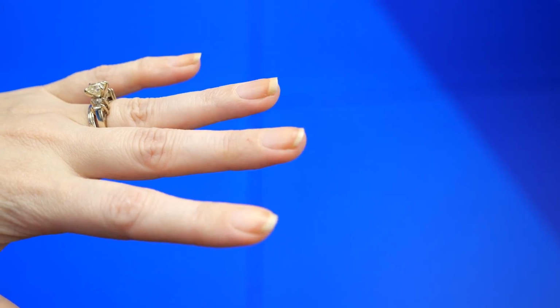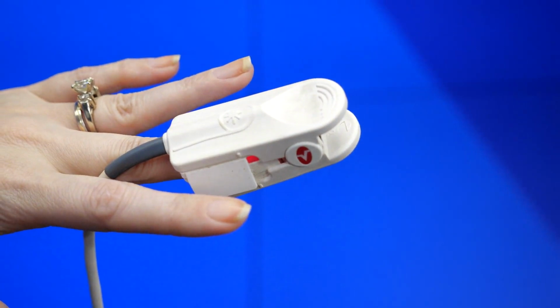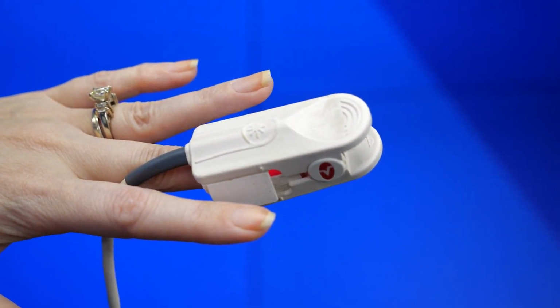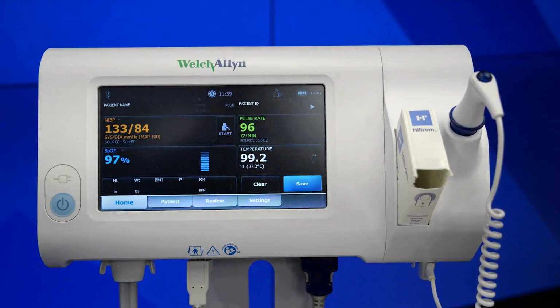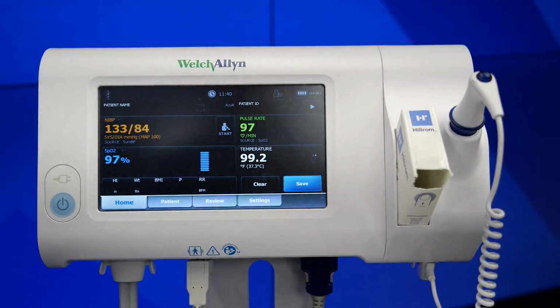To ensure proper placement of the sensor, it is recommended to use the index, middle, or ring finger, toe, or foot. Once the sensor is placed, if signal quality is low, check for the following conditions: sensor position and size to ensure good fit, connection to the monitor, and if the skin is warm and has good blood flow. You can also select a different finger or location for measurement.